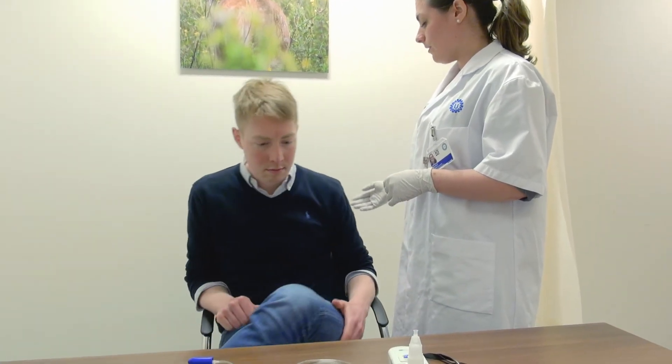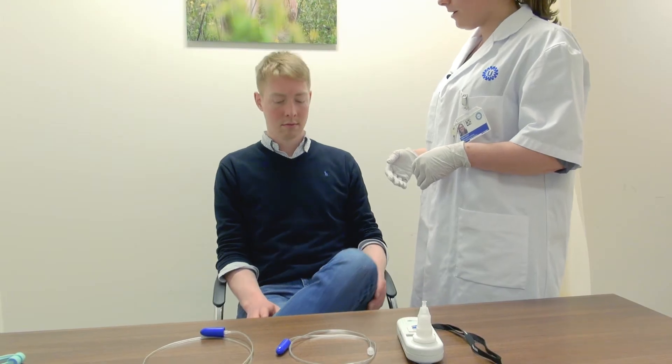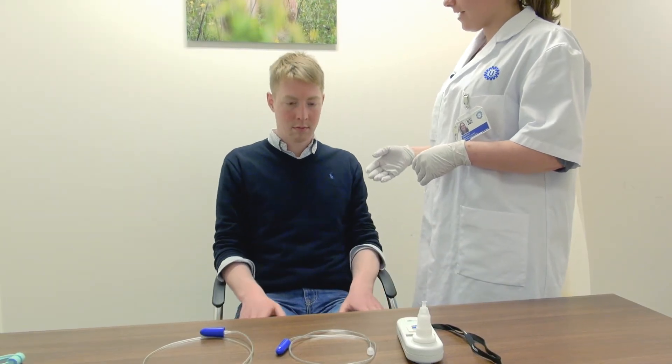Everyone has left the room now, so it's just the two of us. This way, you won't be distracted during the test. Your position during the test is extremely important. You need to be sitting up straight with your back against the back of the chair. Your shoulders should be down, and your eyes should be open. Both of your feet should be on the floor, and your legs should be together.